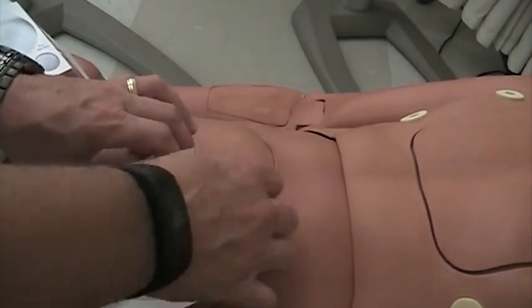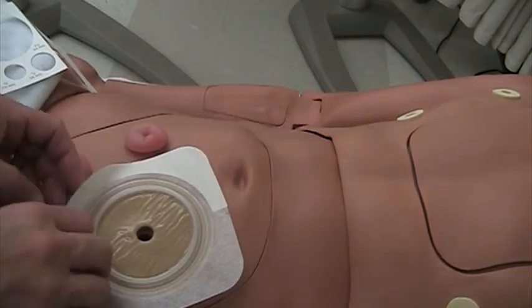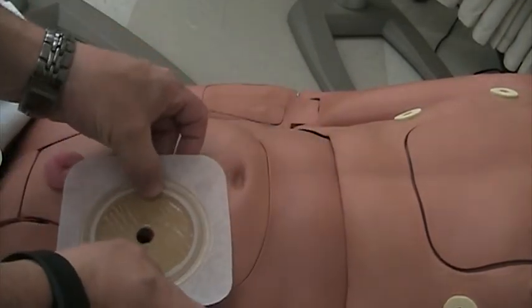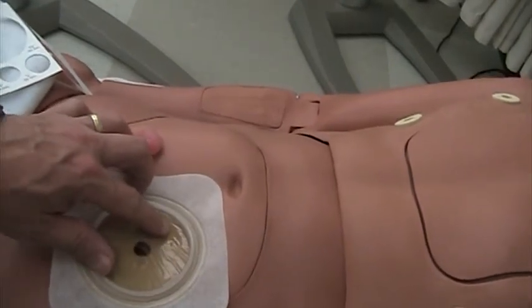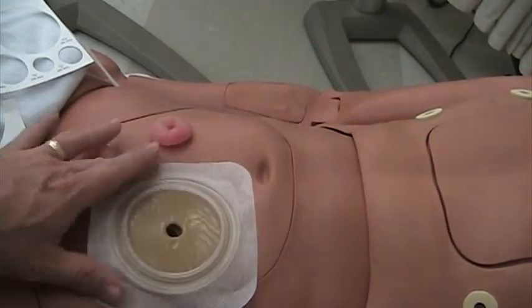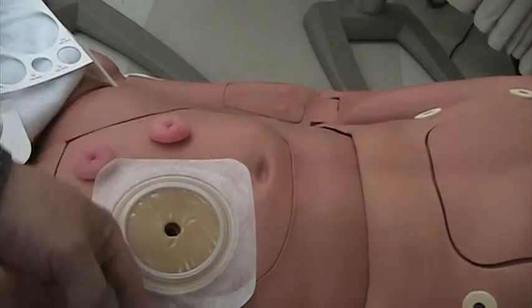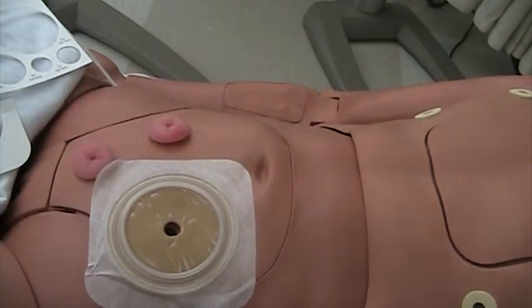Okay, so I've cleaned, this goes around, it's secure. Okay, make it nice and neat. You fit it over the stoma, push down into that stomach. Okay, and you want that a nice tight feel, a seal there, so that gas, flatus, doesn't leak underneath and create a smell. So you want a good tight seal around the stoma.